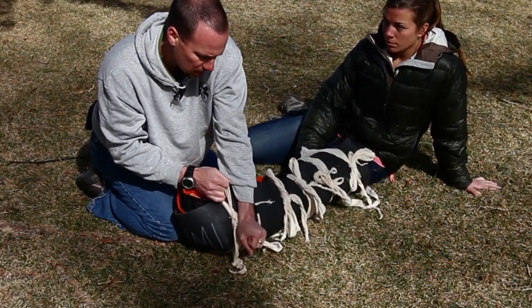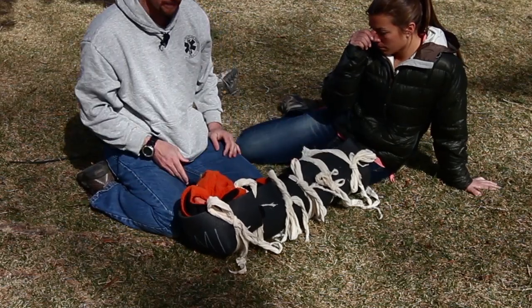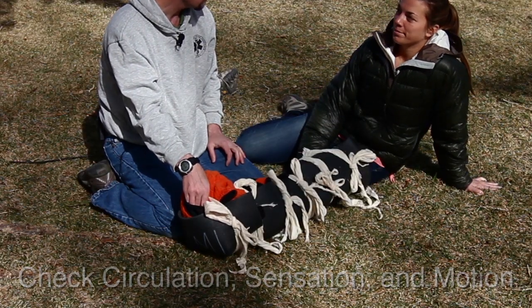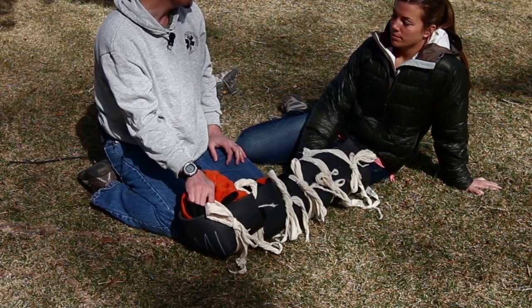Any lower leg extremity can be secured in this fashion. I can still reach in and feel her toes — it feels pretty warm in there. Jordan, which toe am I squeezing right here? A big toe. It's good circulation and sensation, and can you wiggle those? We have some nice movement in there as well.